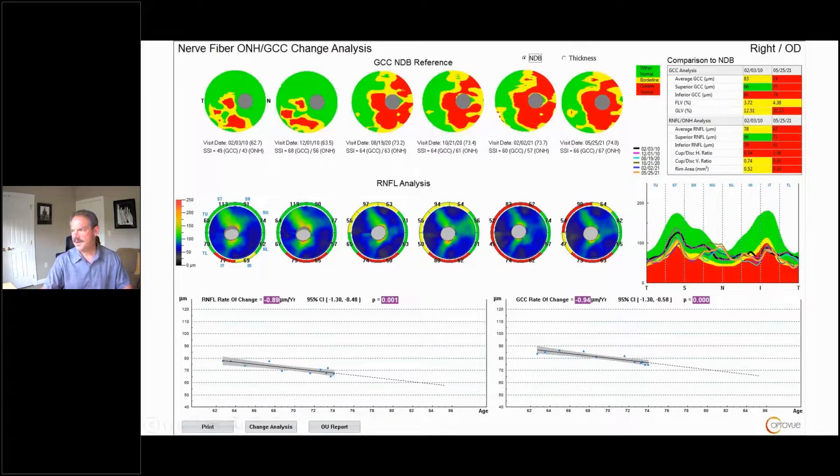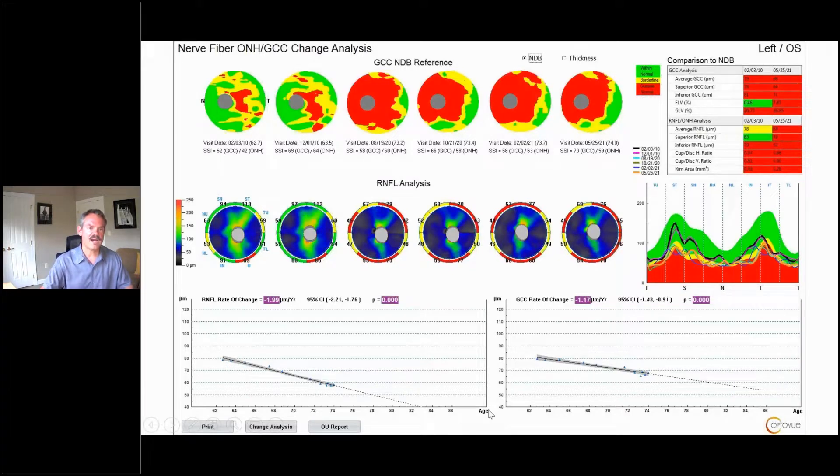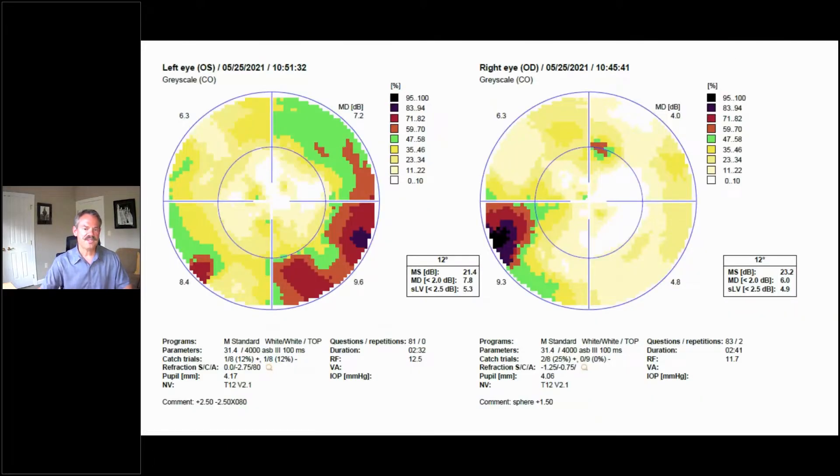We do see, as time goes by, the OCT progressing, both the ganglion cell complex trend analysis and the nerve fiber layer trend analysis. And in the left eye, a similar thing—the patterns are changing.